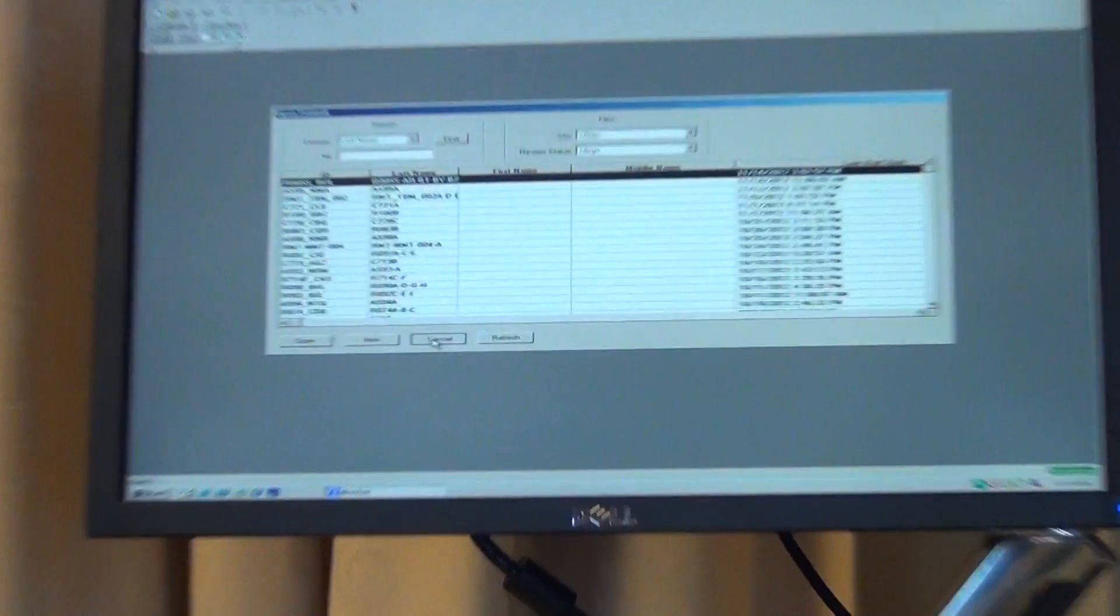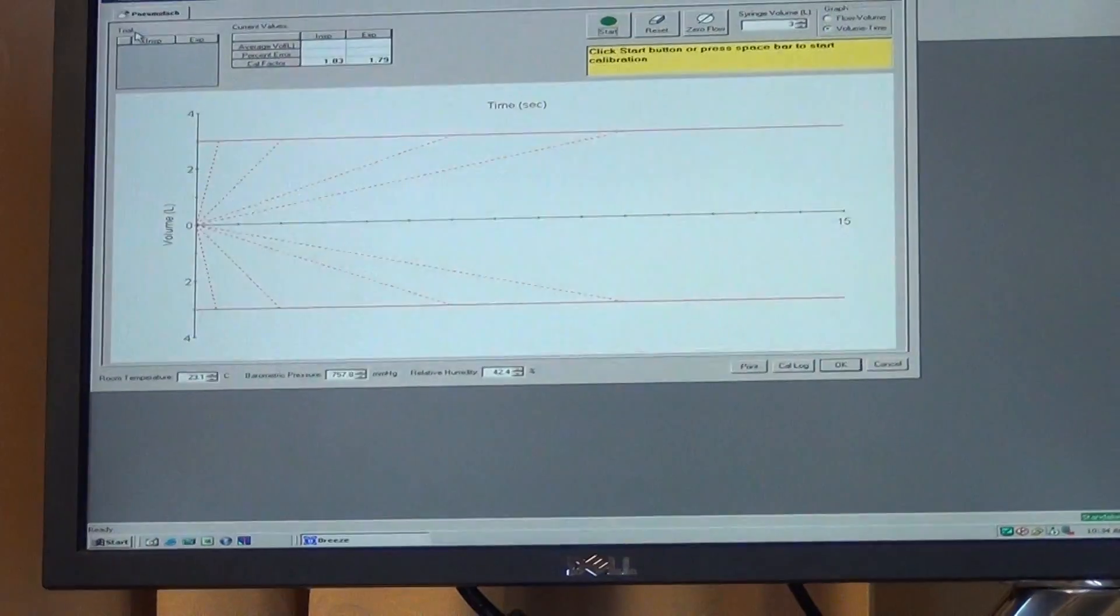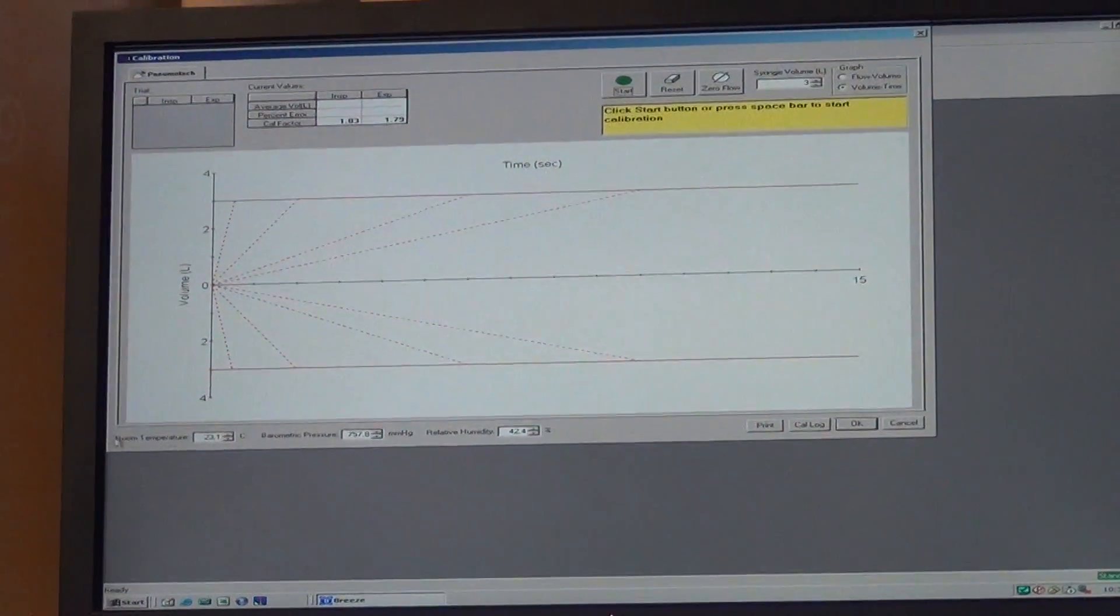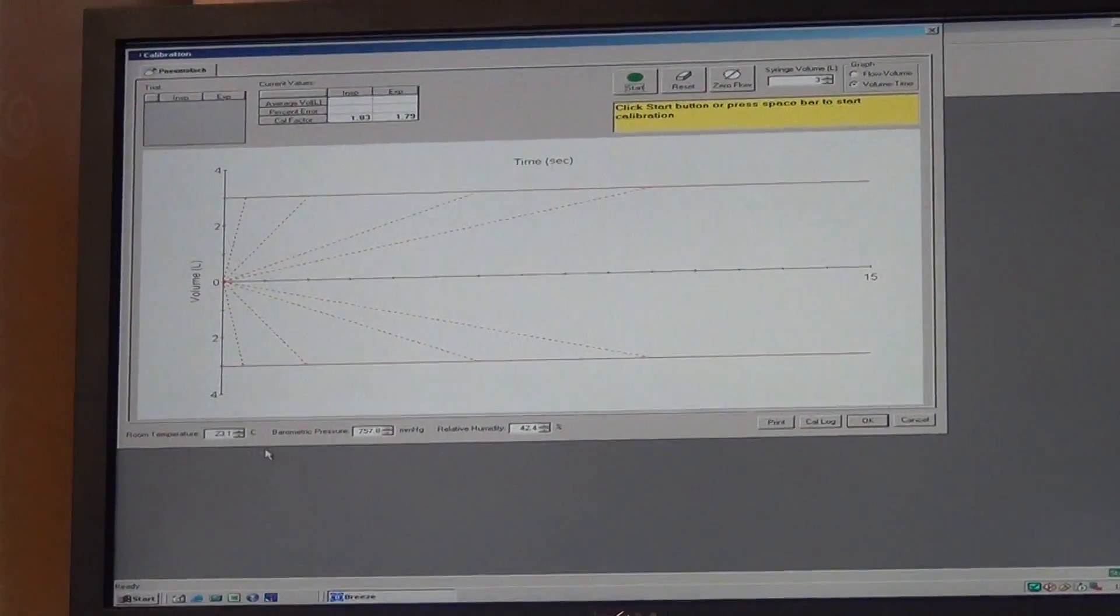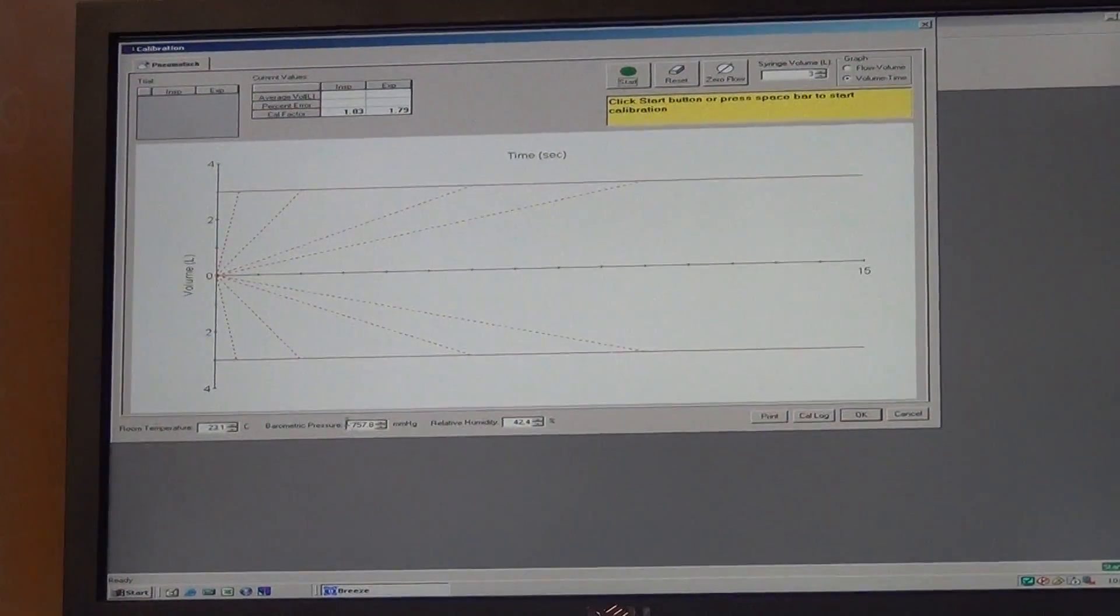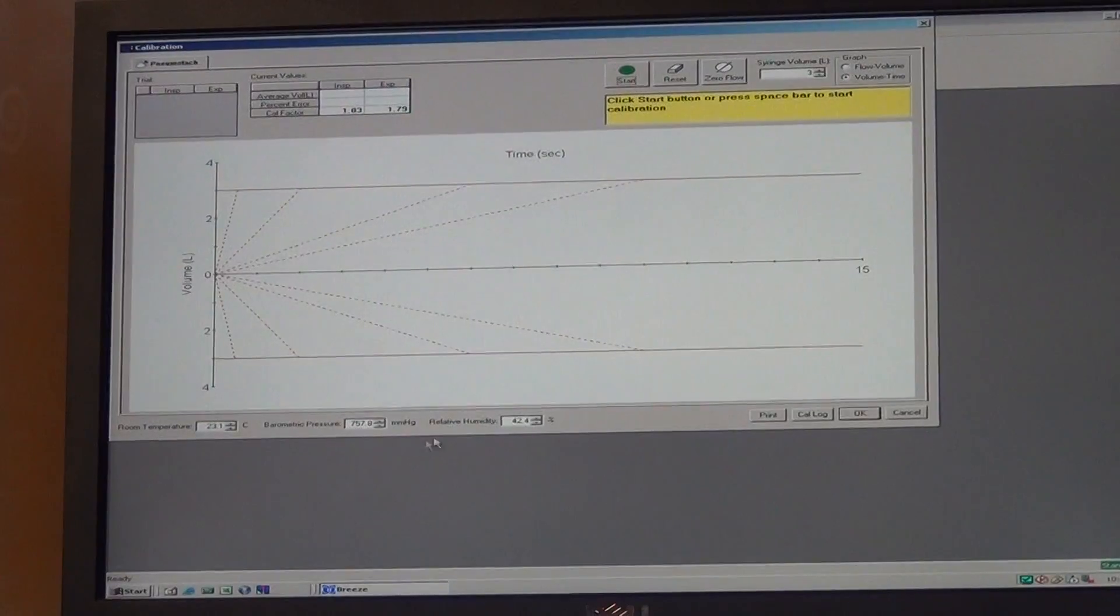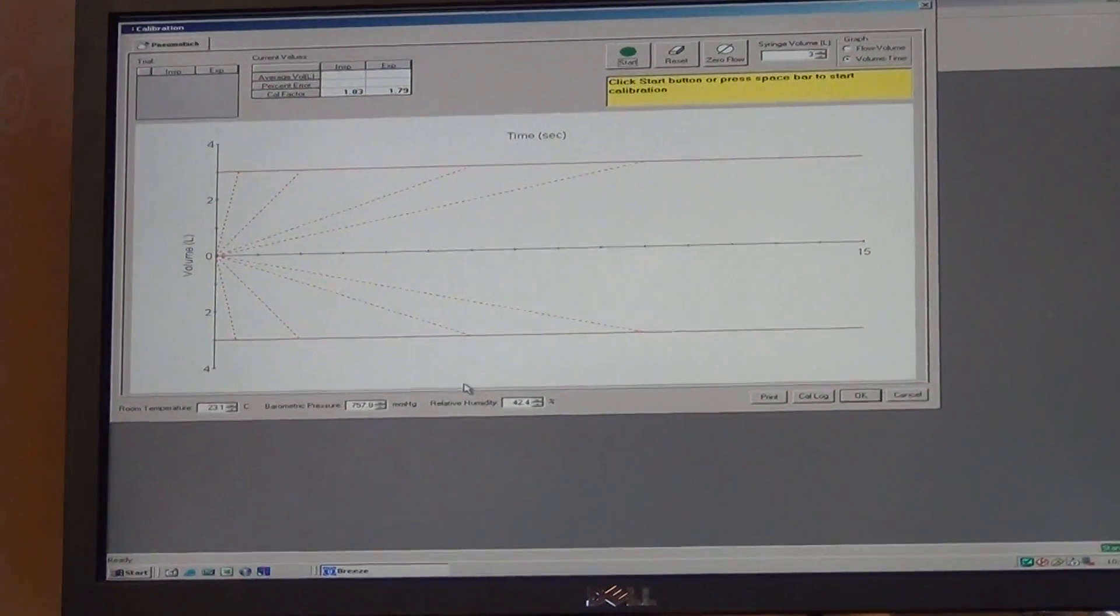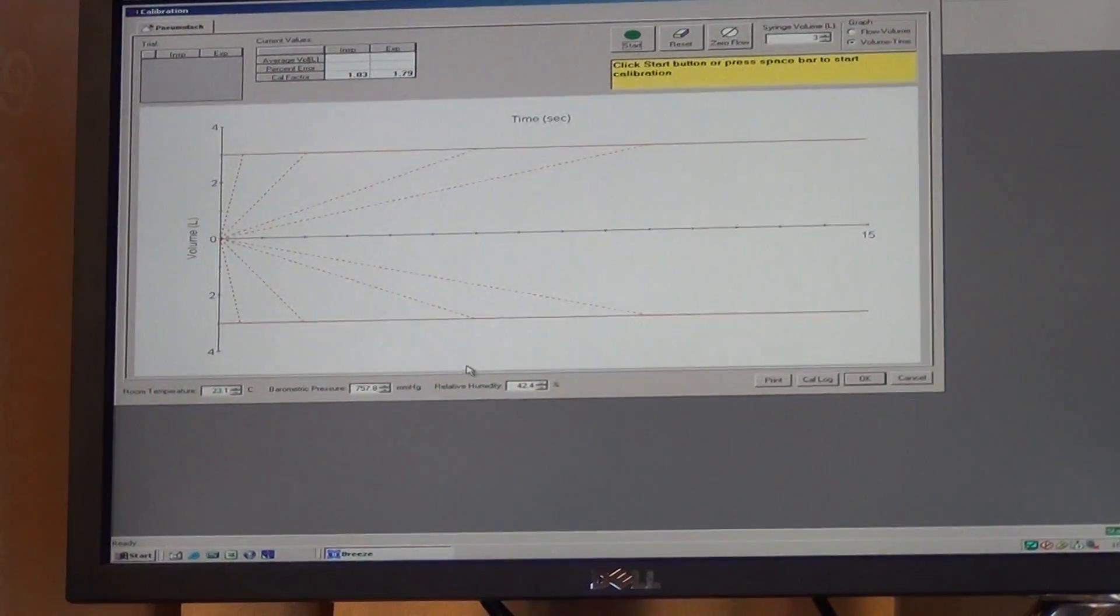Before the test starts, you have to calibrate, so you go up and press the calibrate button. Here at the bottom, you note the room temperature, the barometric pressure, and the humidity. Make sure those values are accurate.